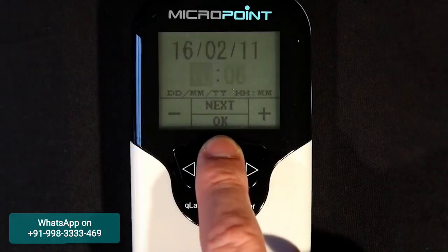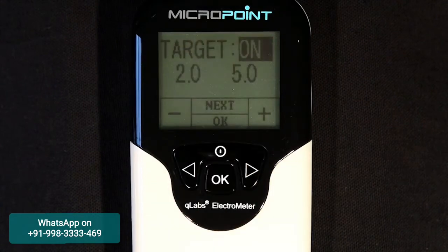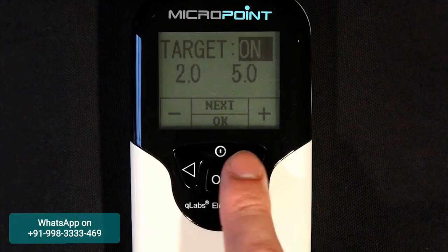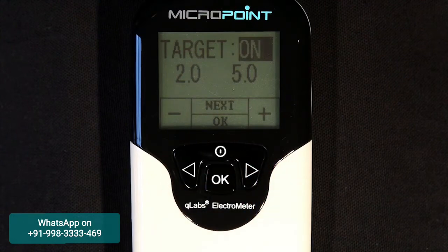In the setup mode, you can change the date, time, and target range settings on the Q-Labs Electrometer. The target range feature is used to alert the user when the INR results are out of range. To activate or disable this feature, highlight the target field and use the plus and minus or right and left buttons to switch between on or off. If the power supply to the Electrometer is disconnected or if the batteries run out, the date, time, and target range settings will be lost and will need to be re-entered.